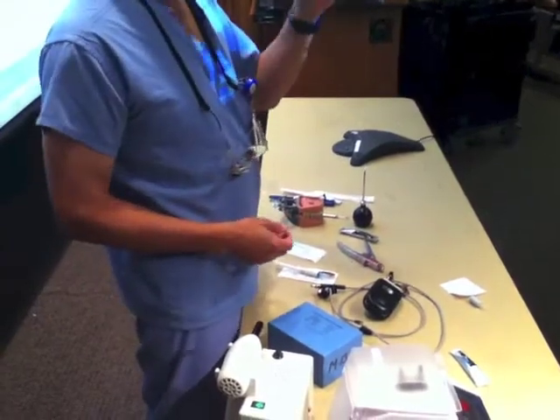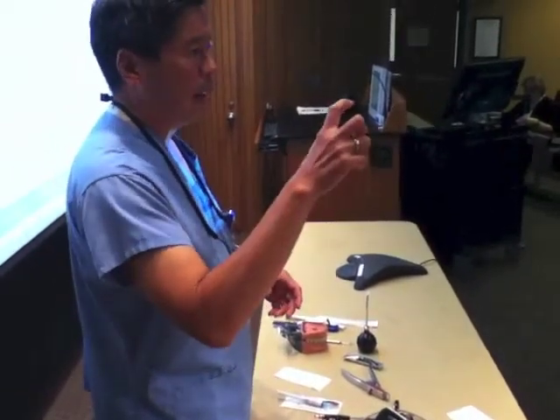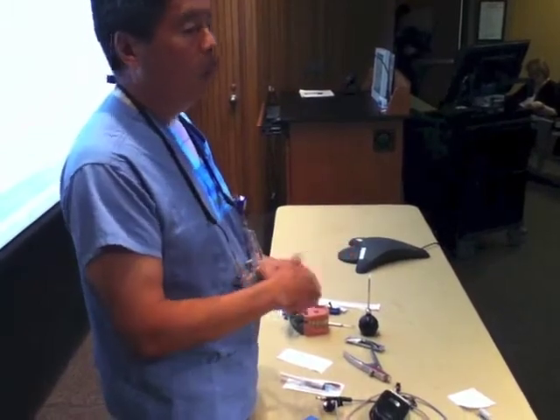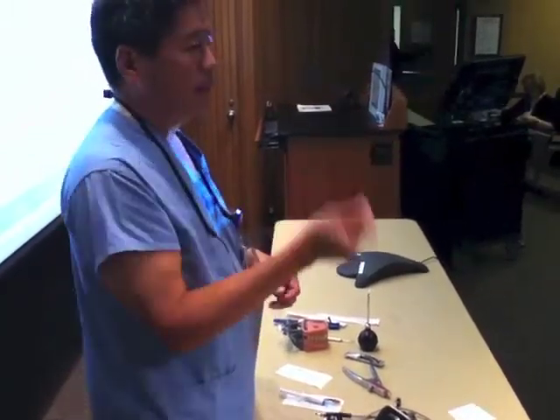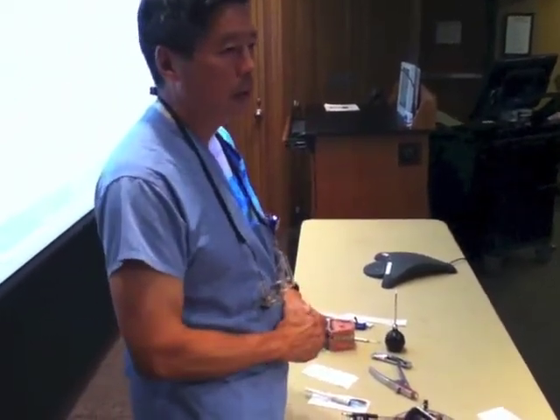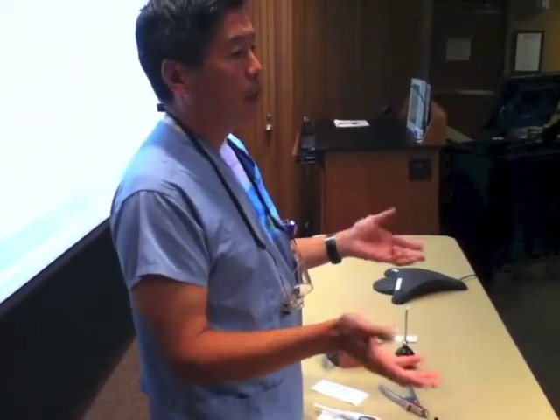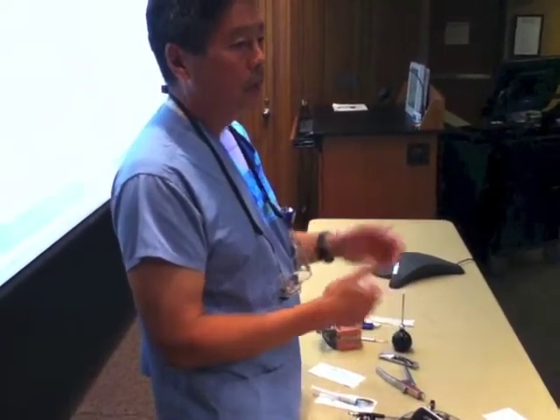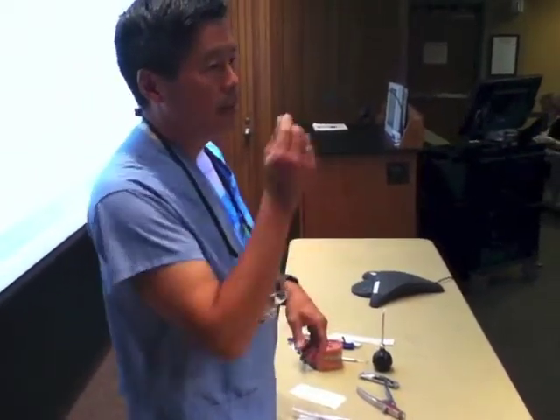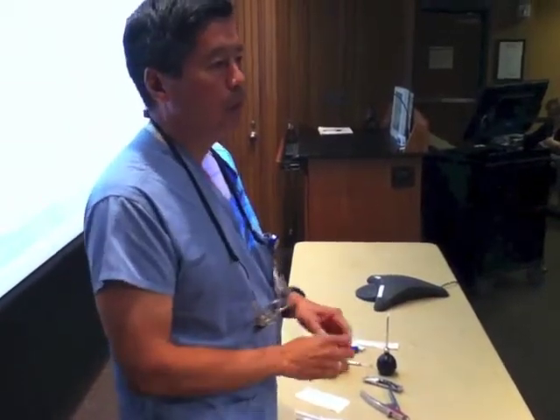We're going to try to rinse out the socket. Don't touch the root. Do we have that Hanks Tooth Saver solution? So as soon as you have a tooth like that, rinse it off with saline and then put it in the Hanks saline while you're anesthetizing. So it doesn't matter how long it's been — we're better off trying to put the tooth back in than not. If it's been an hour and they've got their tooth in hand, first thing you do is rinse it off, put it in the Hanks solution in the Tooth Saver.